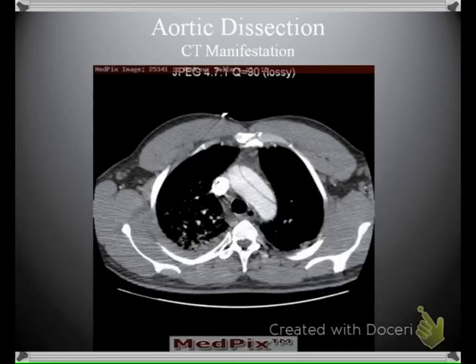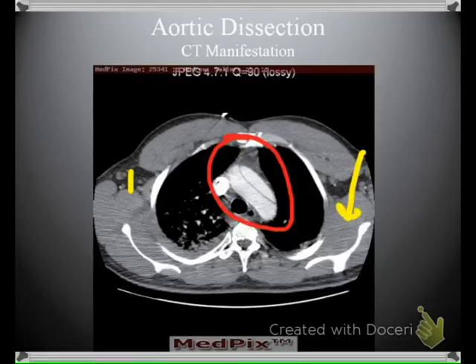Okay, on this type of aortic dissection, notice the location. We are at the aortic arch in this area. We're seeing the scapula here and here, so we're just leaving the shoulder girdle, and we do see that we have a line running here in the aorta. This is type A aortic dissection, very dangerous, and as we can see, it would have a great mortality rate simply because of the location being very hard to get to and very hard to remedy.